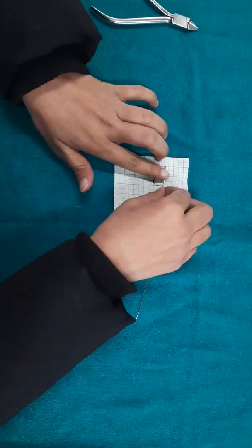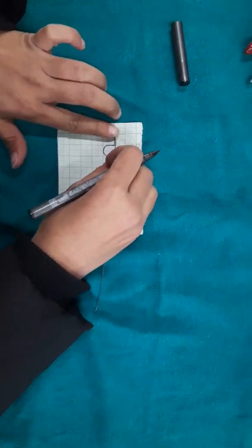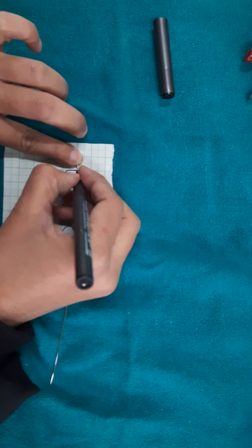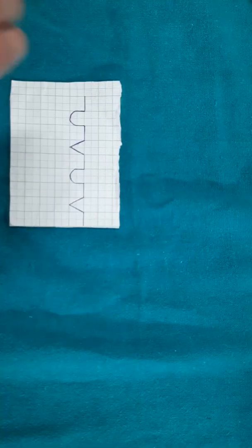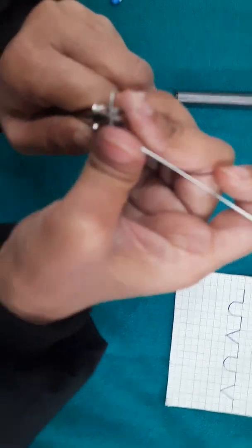Align the wire to a horizontal line on the graph paper and mark a point 1 cm away from the end. Now keep the plier on the mark and give a sharp 90 degree bend.